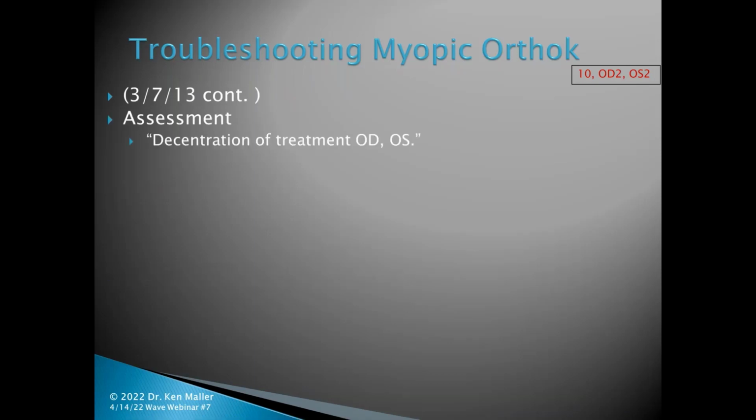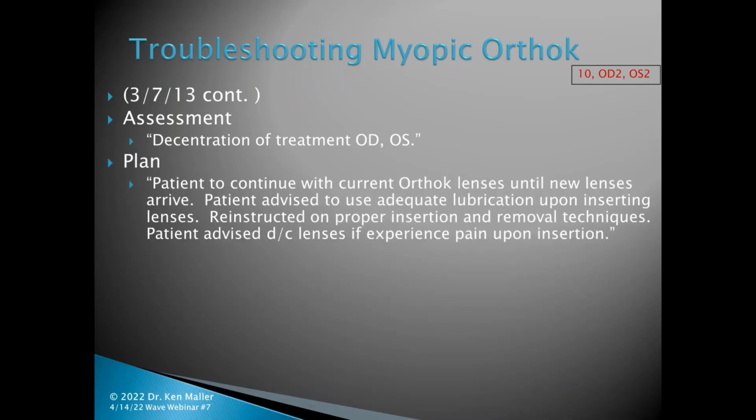Continuing on that day, decentration of treatment OD and OS. Patient continue with the current Ortho-K lenses till new lenses arrive. Patient advised to use adequate lubrication on inserting lenses, re-instructed on proper insertion and removal technique, and advised to discontinue lenses if experience any pain on insertion.